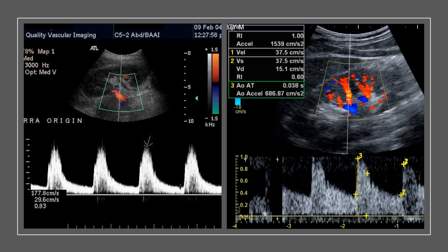All things to be aware of and things that are very common for techs to mix up. Other than that, it's a beautiful picture. We are Dopplering the renal artery in that distal region at the hilum. We're getting a peak systolic velocity measurement here, and an end diastolic velocity measurement here. The only thing we truly care about in this region is the peak systolic, and then we add that in combination with the aorta information to get our RAR.